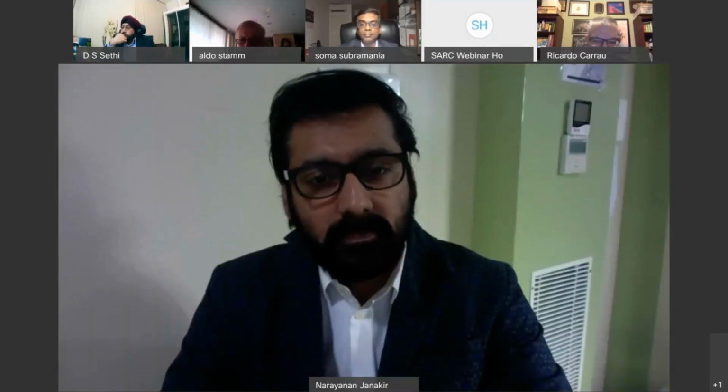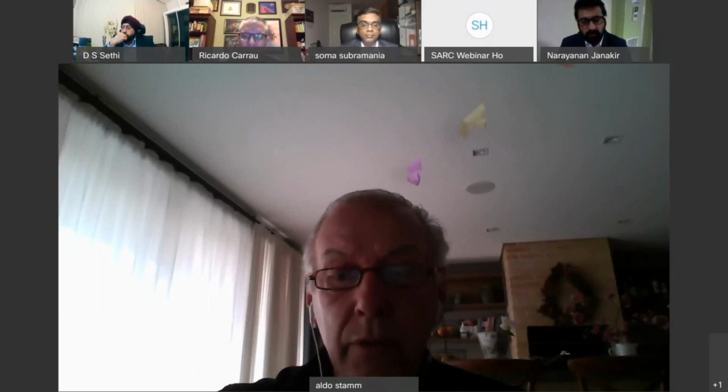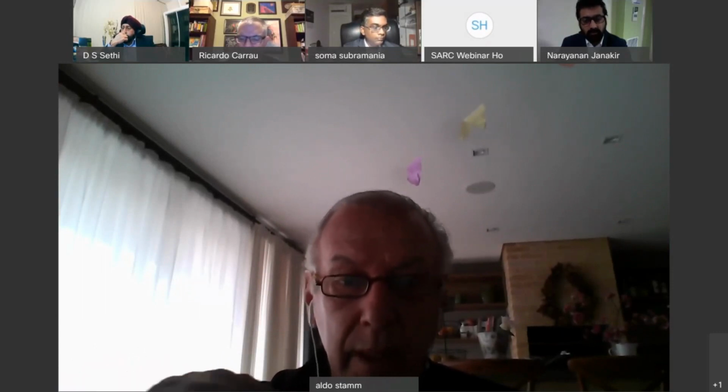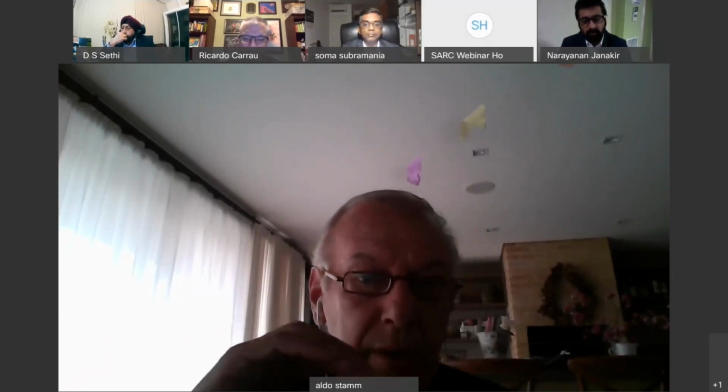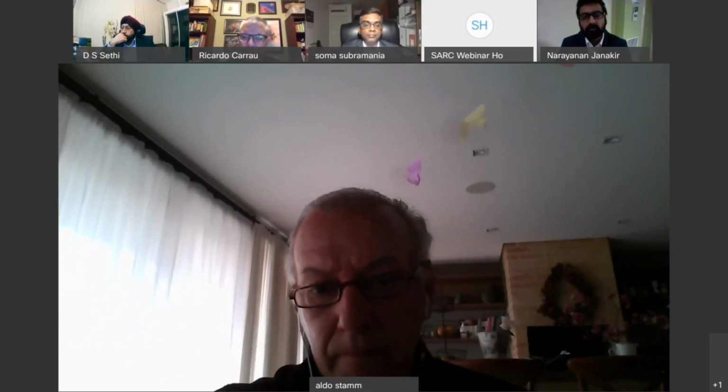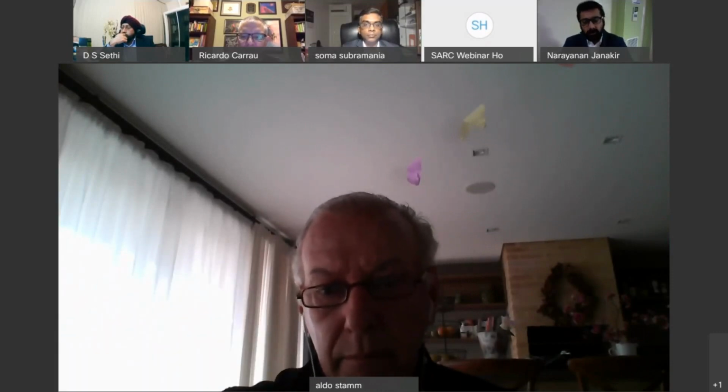When I drill over the internal carotid canal, I prefer to use the conventional diamond burr instead of the coarse diamond, and keep a very thin bone shell on, and then remove it with the Carrau punch. So again, it's just preference.